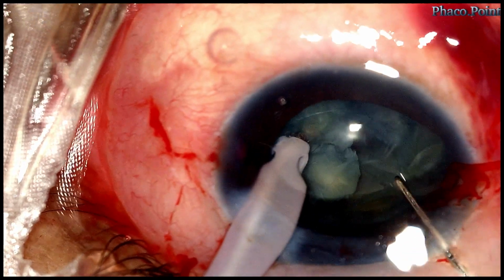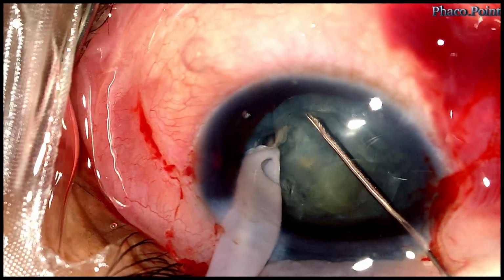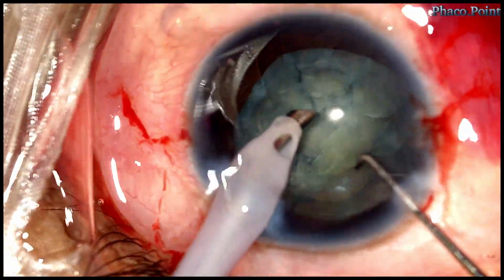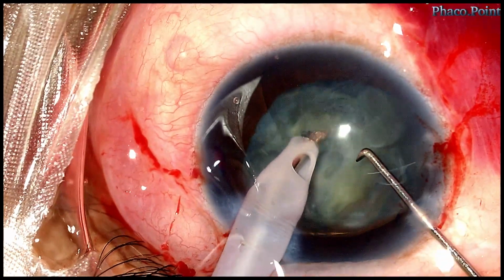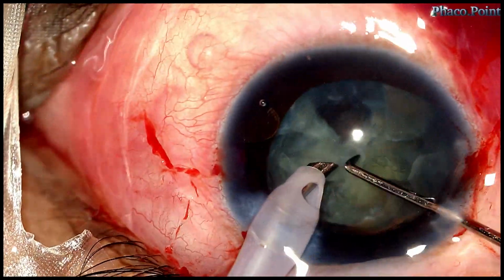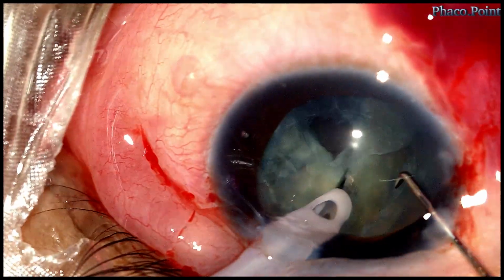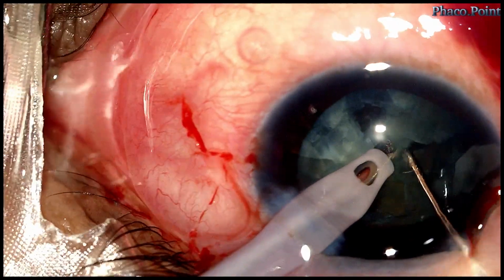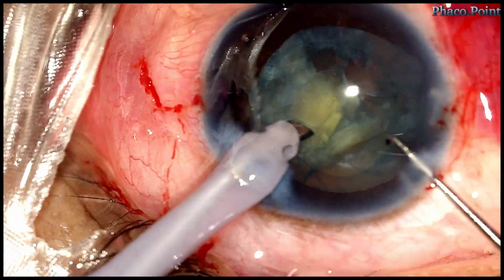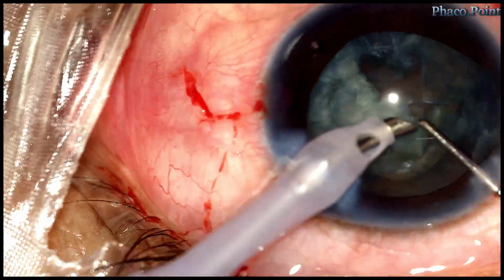Without rotating the nucleus, I turn the tip in either direction and break down the nucleus into smaller fragments. Once the first fragment has been removed, I then turn to the other side, impale into that heminucleus, break it down, bring out the fragment and emulsify it. Now I'm actually left with a rather large fragment.